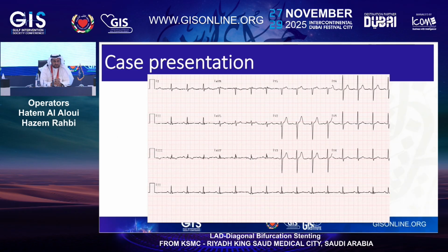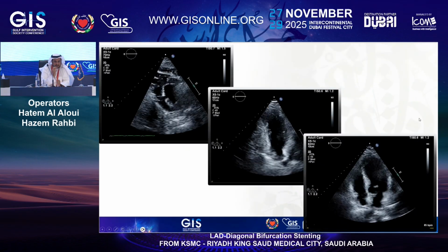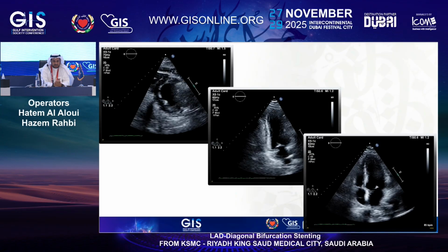So these are his labs. Slightly increased troponin level on admission, and it peaked up to 7,000. He is relatively well controlled in terms of diabetes mellitus. Creatinine is okay. This is his echo. Some regionality in the inferior territory. Good ejection fraction. And this is the angio.